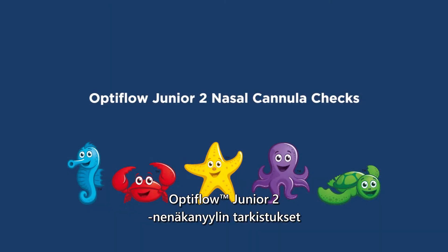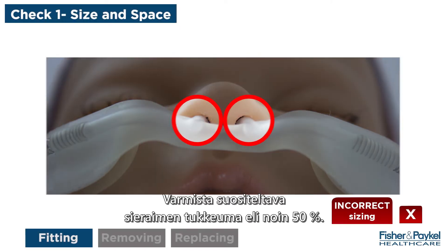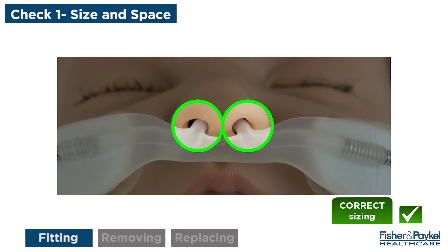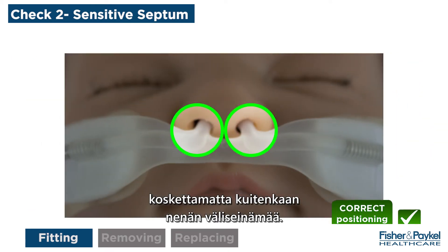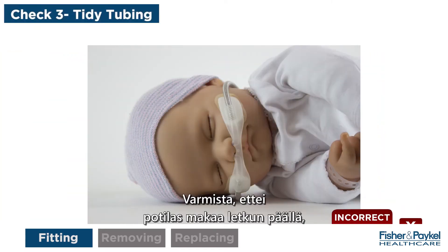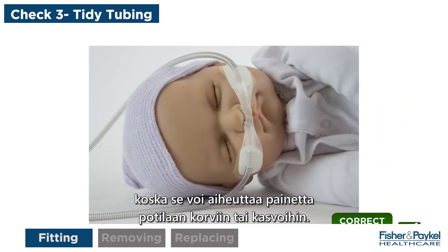Optiflow Jr. 2 nasal cannula checks. Ensure the recommended nare occlusion is approximately 50%. Ensure the cannula bridge rests close to the nose without touching the septum. Ensure the patient does not lie on the tubing, as this may apply pressure to the patient's ears or face.